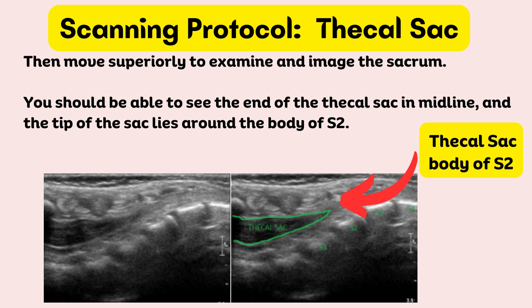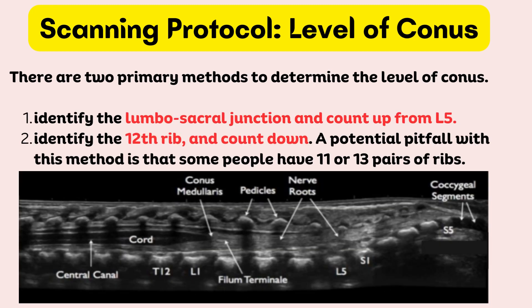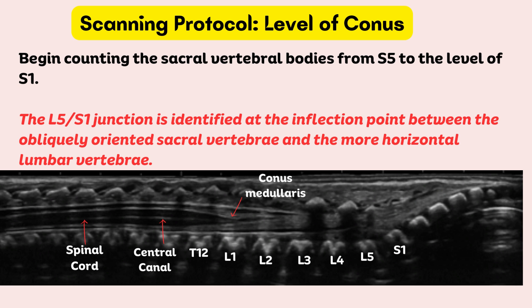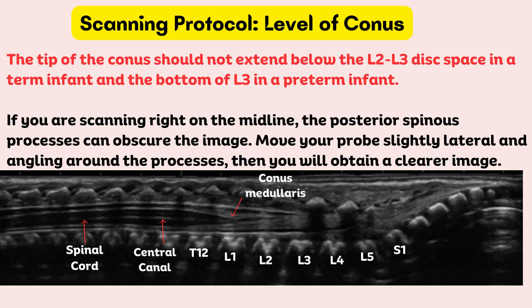Then move superiorly to examine and image the sacrum. You should be able to see the end of the thecal sac in midline, and the tip of the sac lies around the body of S2. Next, we need to determine the level of the conus. There are two primary methods: the first is to identify the lumbosacral junction and count up from L5; the second is to identify the 12th rib and count down. Begin counting the sacral vertebral bodies from S5 to the level of S1. The L5-S1 junction is identified at the inflection point between the obliquely oriented sacral vertebrae and the more horizontal lumbar vertebrae.